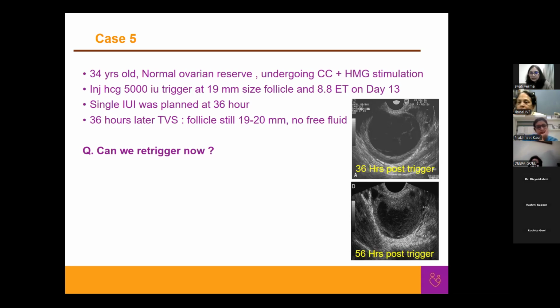Another thing is that in the endometrium, you can see vascularity up to zone 3 and zone 4 very easily. It's not very difficult. What I adopted as a practice was noticing vascularity after giving the trigger. Once the trigger was given and the follicle was ruptured, I started learning how to do a Doppler ultrasound. Then I followed the same thing before giving the trigger. That is how I developed my practice of doing color Doppler on the follicles.